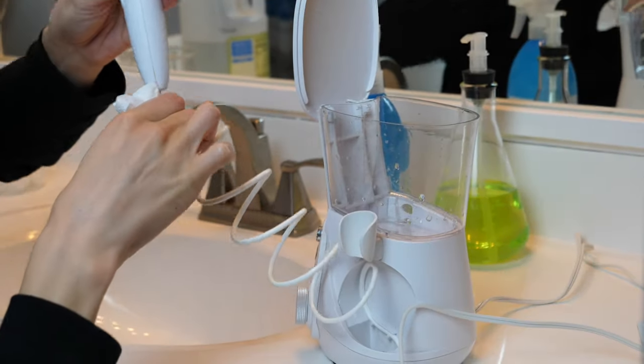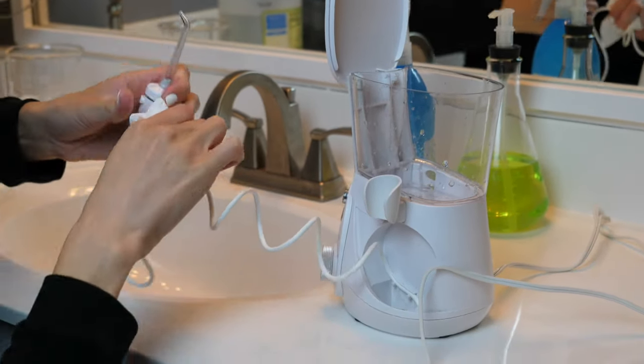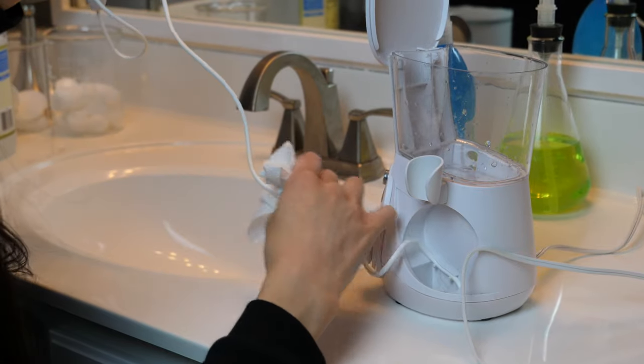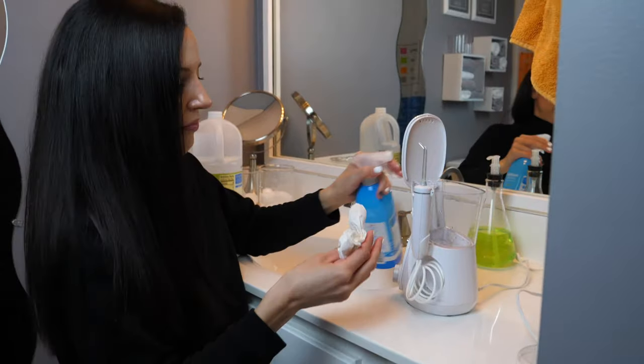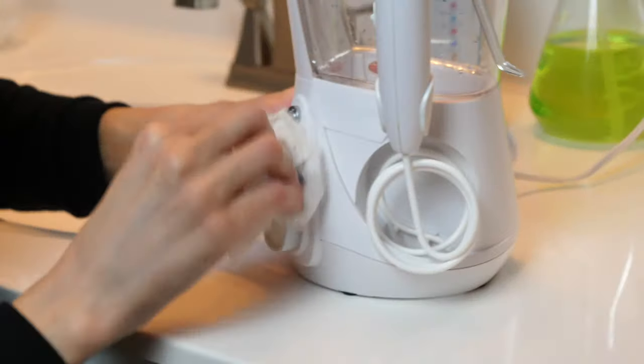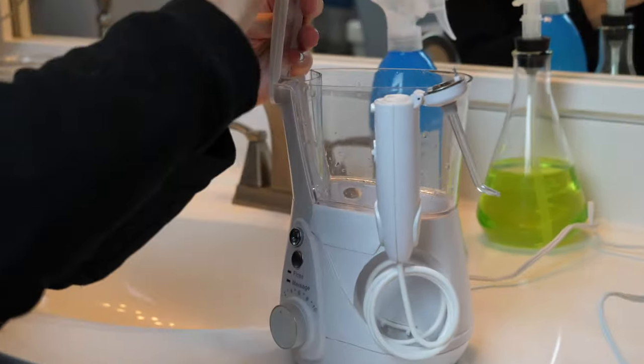First, I literally just clean the outside of the whole unit with a paper towel or soft cloth. It says to use a non-abrasive cleanser — I just use whatever I clean my sink and counters with. By the way, make sure the unit is unplugged when you're doing this.